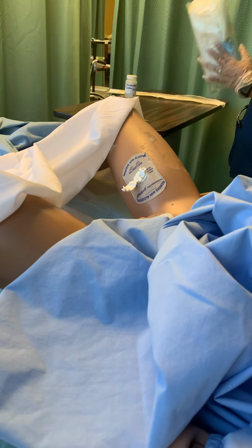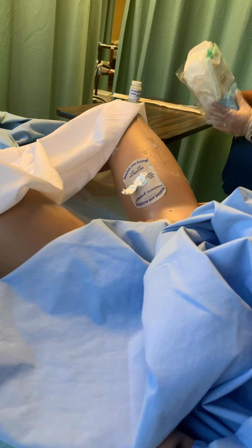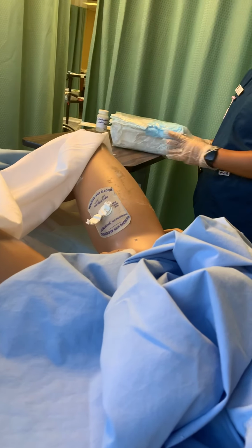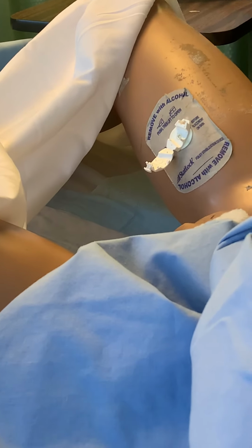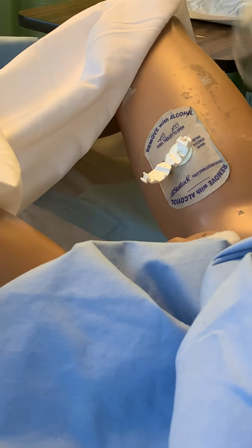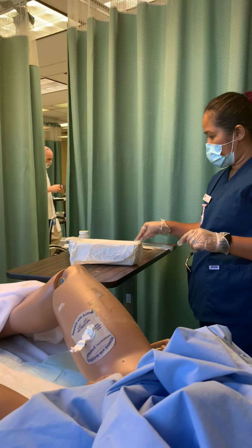When you open this, make sure to check for any yellowish abnormalities in the bag, like if it's used, open, or wet. If used, you're not allowed to use it. Then you just rip it and make it like toothpaste. This one I have to put beside the patient. This one you can use as a garbage too. Just put it beside you, not too far, not too close, because you're not allowed to bend once you're sterile. This one, not yet.